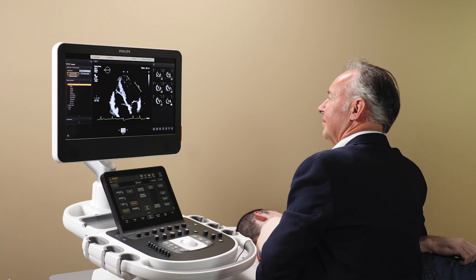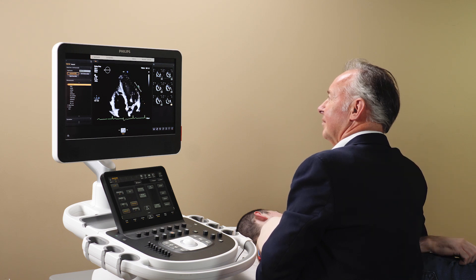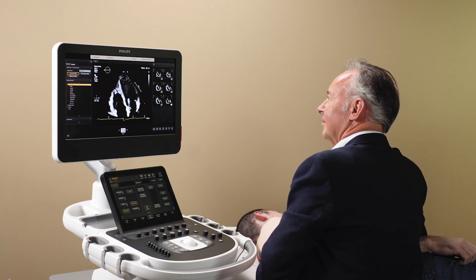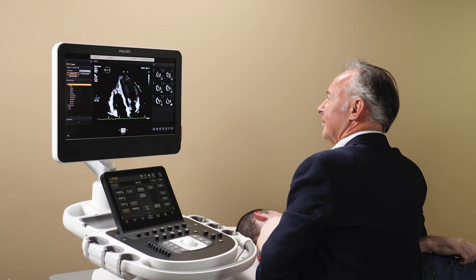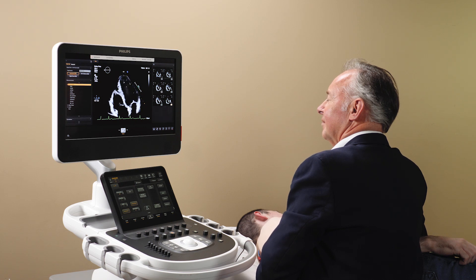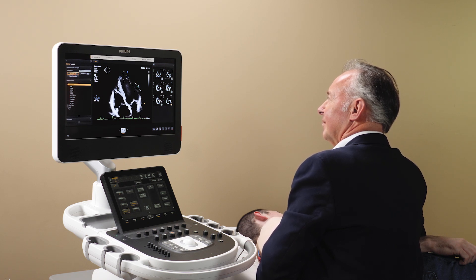This is the most reproducible apical view of the right ventricle, allowing assessment of the right ventricle insertion point by avoiding RV foreshortening.